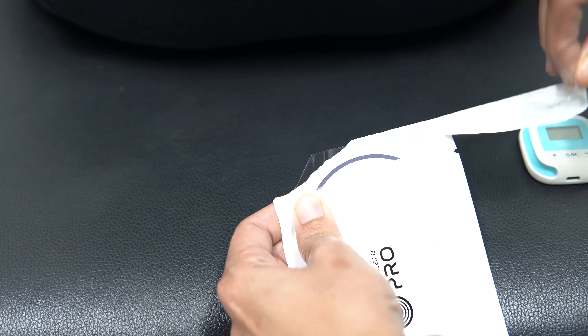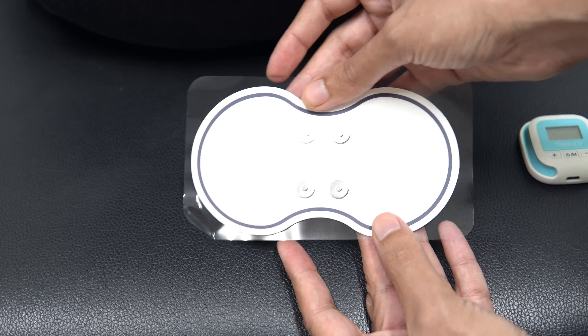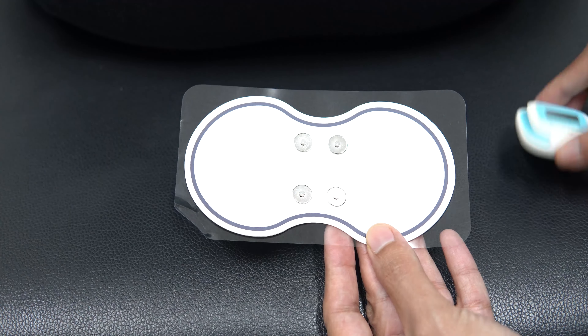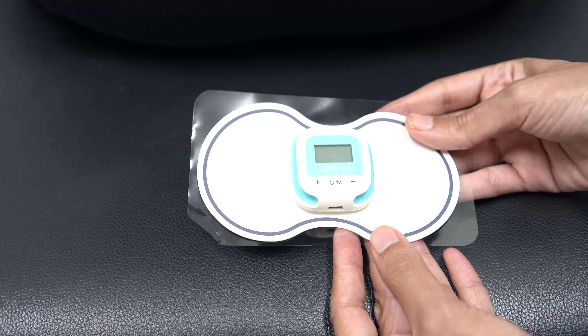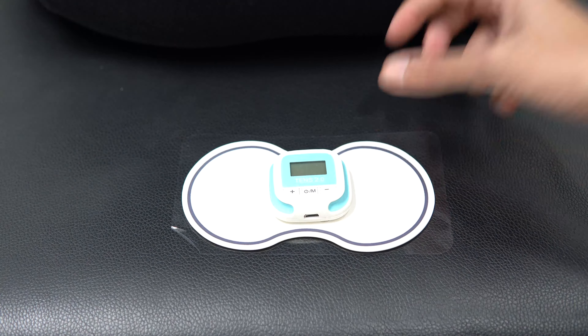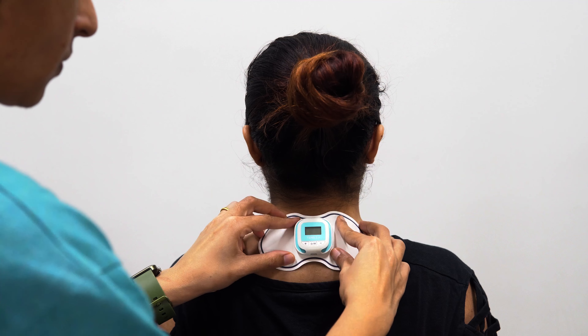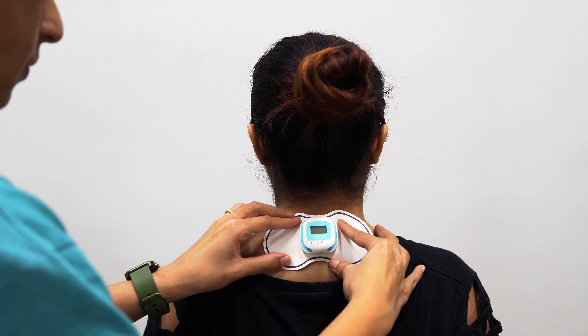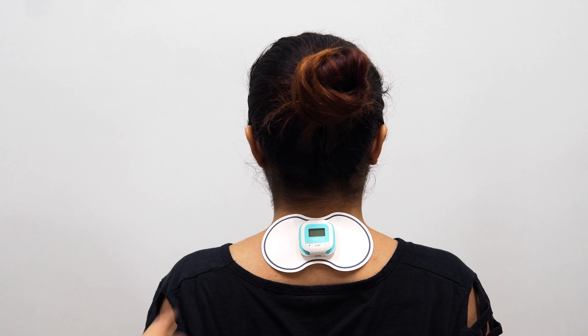Now you need to attach this electrode with the TENS device. Let's unpeel or open the packet — as you can see, it has a back side attachment, and on the front side there are four magnetic lids which have to be attached to the product, as you can see on the screen. Once attached, you can very easily place this product over the area where you want to take therapy.